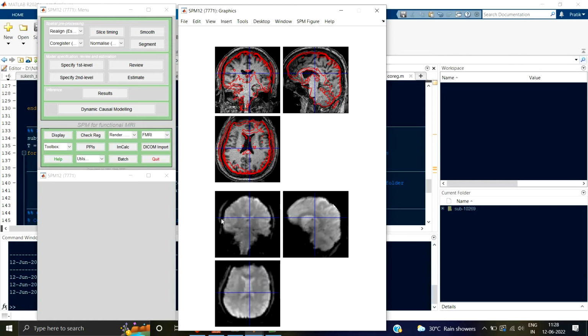If you can see, normally the functional images don't have a lot of skull. They are mostly just brain images. I mean, they may have some, but you can see mostly they don't. So what you can do is remove the skull from the anatomical image, so that will give the algorithm a better reference. So that is one way.